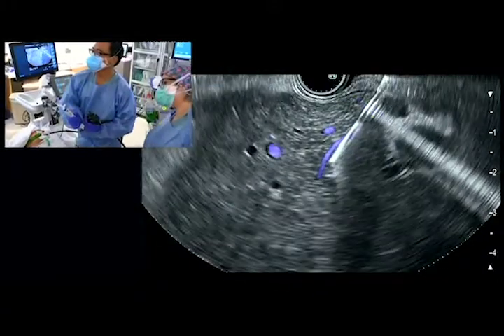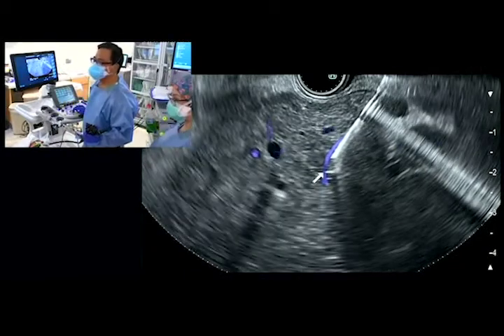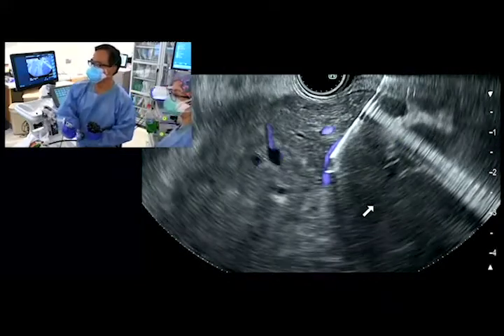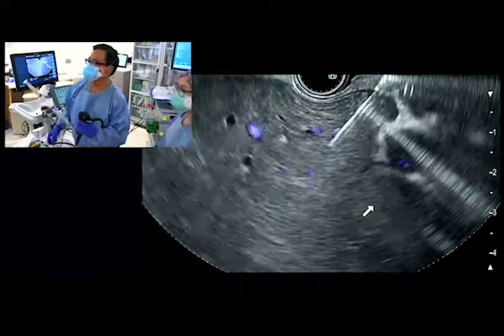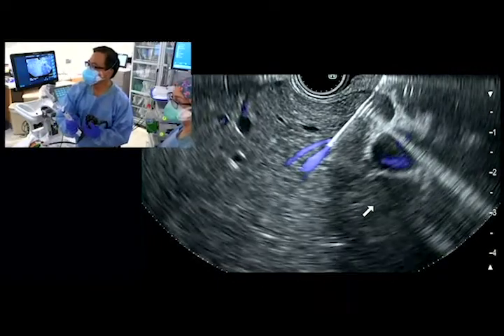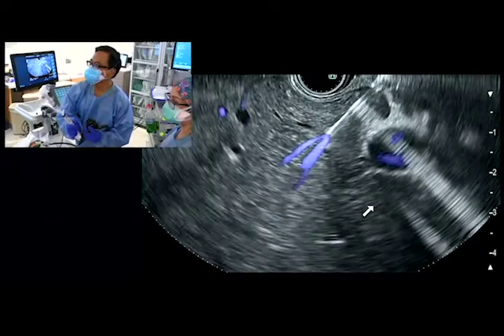After the final actuation, E-flow Doppler shows persistent flow within the biopsy tract, which was not seen prior to liver biopsy. We then wait two to three minutes for spontaneous hemostasis. In this case, flow persists, therefore the blood patch technique is used to facilitate hemostasis.